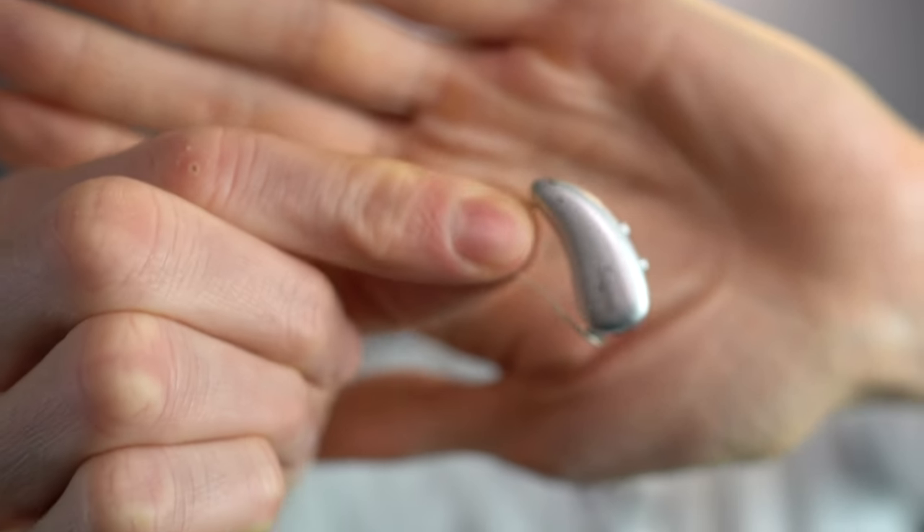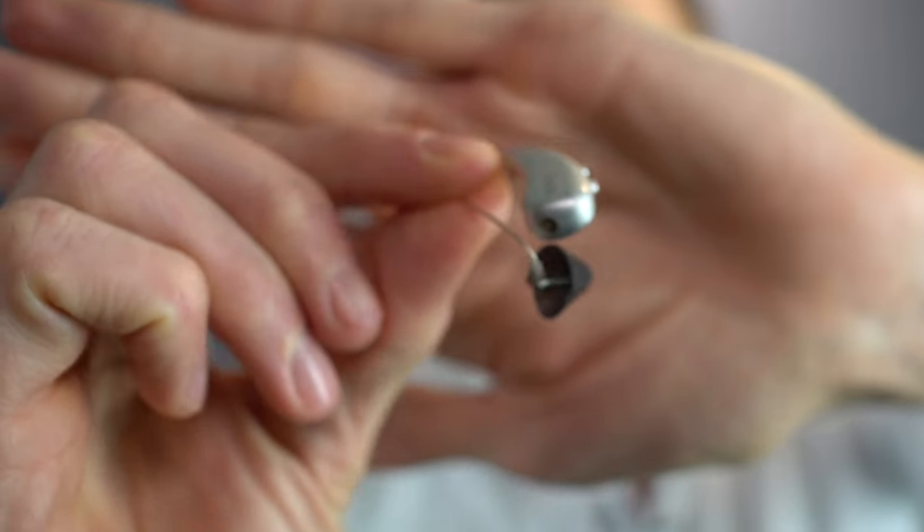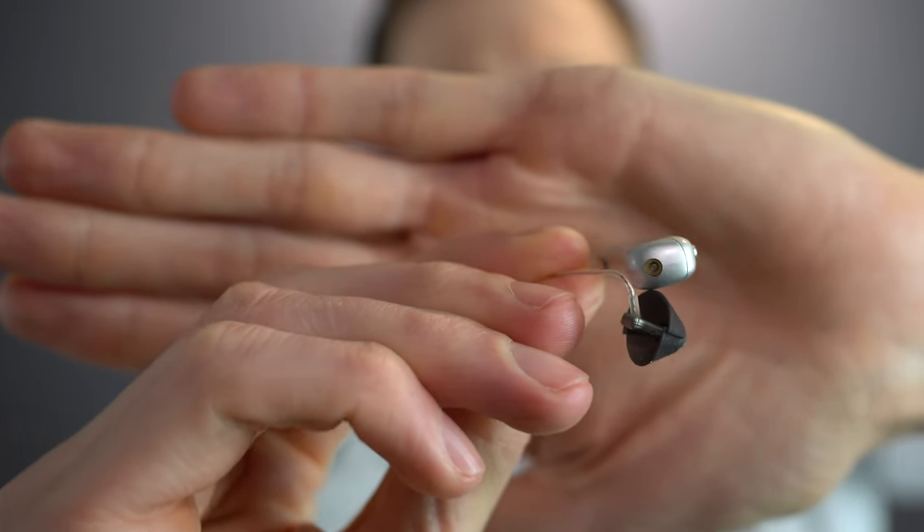Let me get back to the charging contacts. If you spin the hearing aid around to the bottom, you can see that little gold plate — that's the charging contact that makes contact with the bottom of the charger. The problem is you can build up debris around that contact point, so you have to keep it clean. If you don't, it can interrupt charging and you'll end up with dead hearing aids.